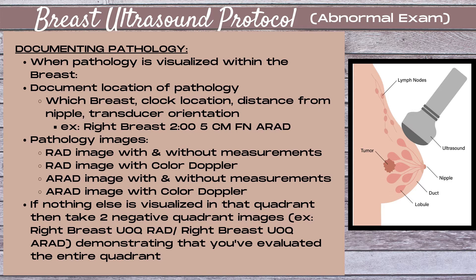Note that the measuring process is exactly the same as for a lymph node. It doesn't matter if you do two measurements in radial and one in antiradial, or two in antiradial and one in radial — follow the protocols of your specific site. What's most important is that you ensure you're doing the three correct measurements: a length, which is a horizontal measurement; a height, which is a vertical measurement; and a width, which is also a horizontal measurement.